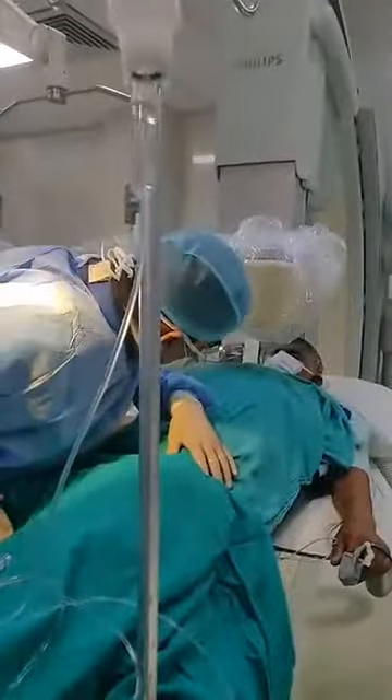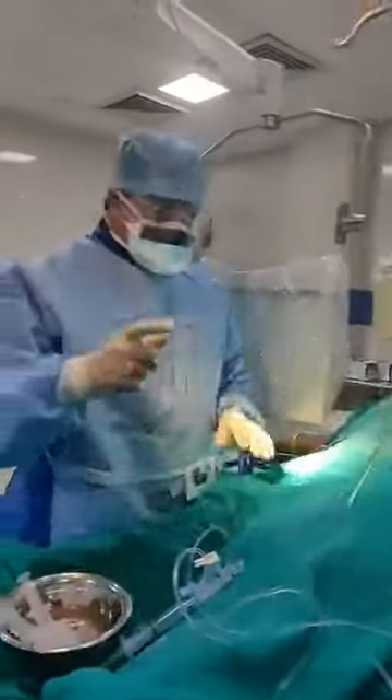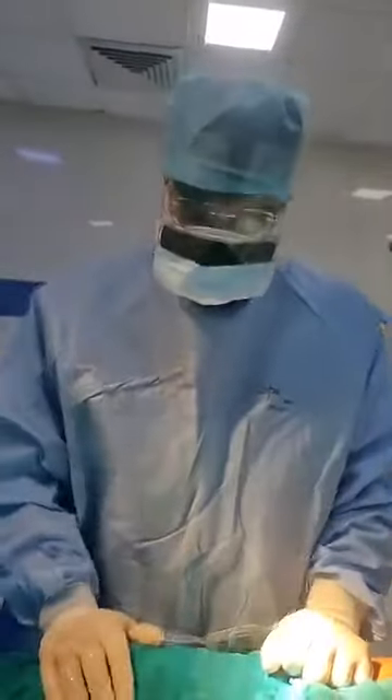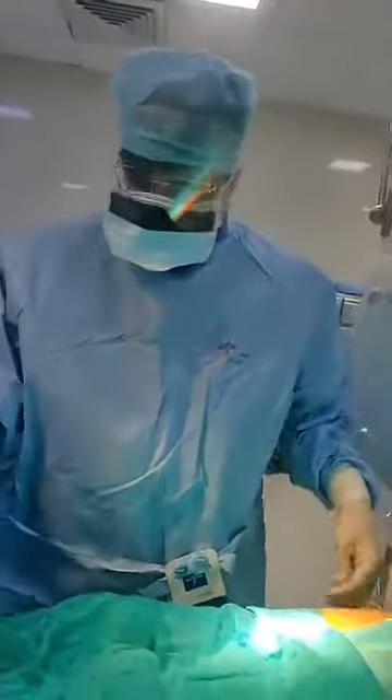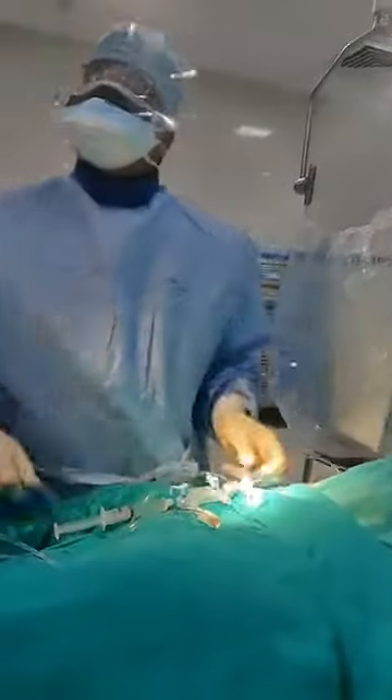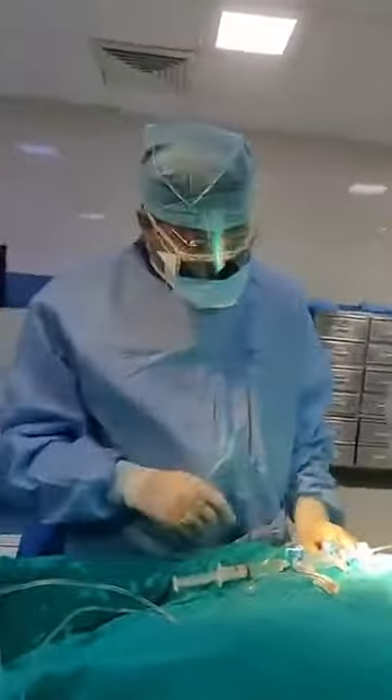The patient is fully conscious. We have done the first part of this procedure, which is putting the sheath at the groin artery. Then we connect this to the tube and we check the pressure of the patient. We have to give some fluids.